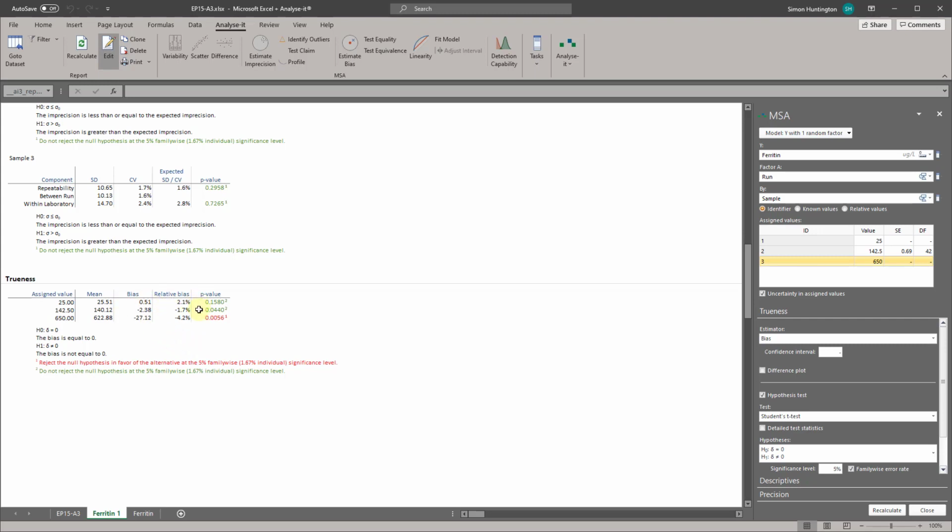The hypothesis tests for level 1 and 2 are not significant. But for level 3, the bias is significantly different from zero and is highlighted in red. You should therefore determine if the bias is acceptable for your laboratory's needs by comparing it to user-specified allowable bias, or contact the manufacturer for further assistance in diagnosing the problem. If the hypothesis test is not statistically significant, but the bias estimate is much larger than zero, you may want to repeat the study with more data to be able to detect smaller departures from zero.